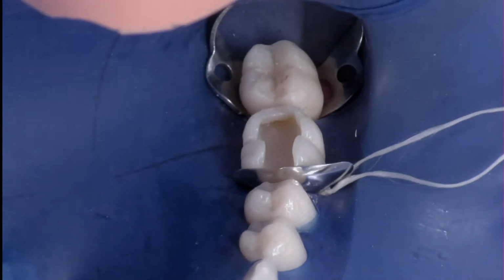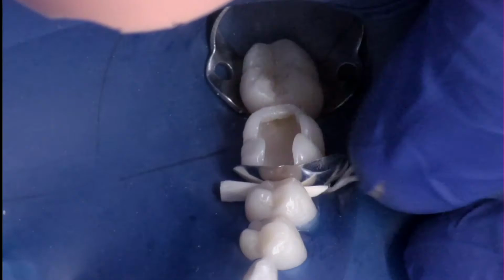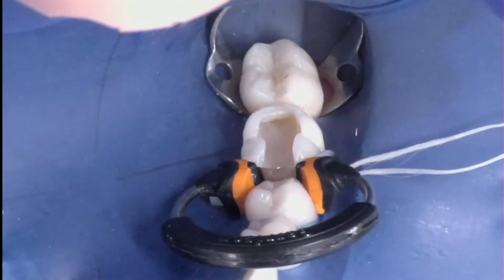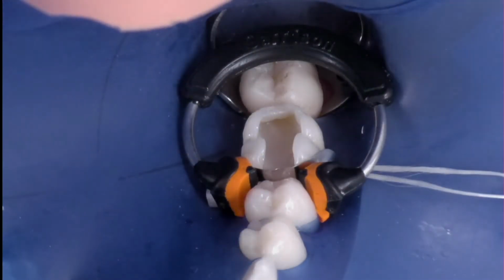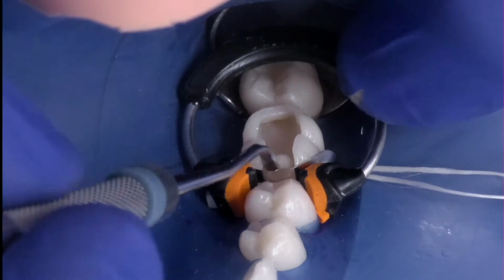Now, I generally like to cut the Garrison matrix bands to make it very, very close to the marginal ridge of the proximal tooth. However, in this case, it looked to me to be about maybe 1.5 millimeters above, which is still a little bit high. I want it to be like 1 millimeter or less, but I kind of went with it.